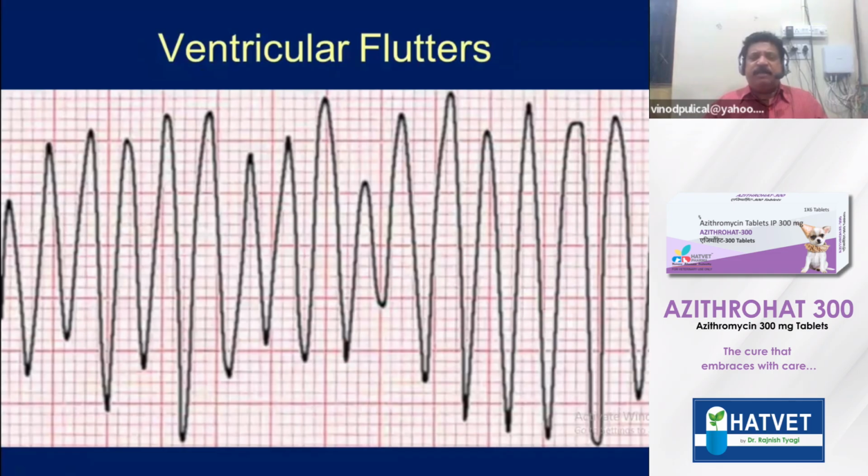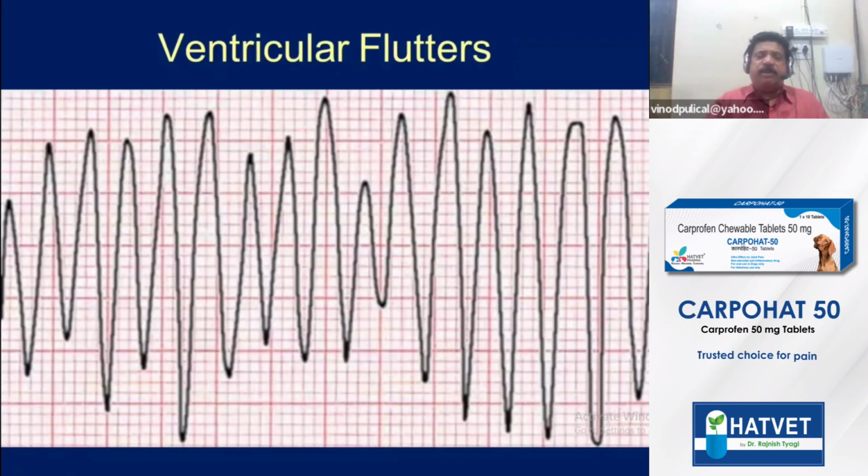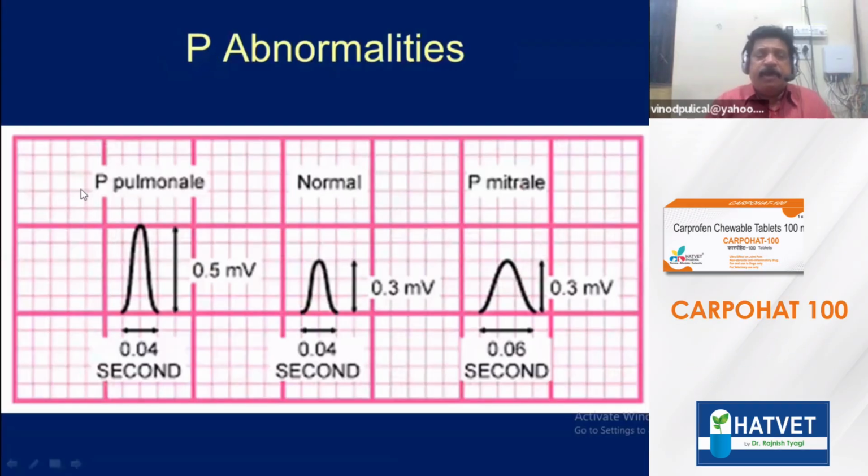Then ventricular flutter. There is no clear-cut contraction or sinus complexes. It is also just like ventricular fibrillation. It is so dangerous.